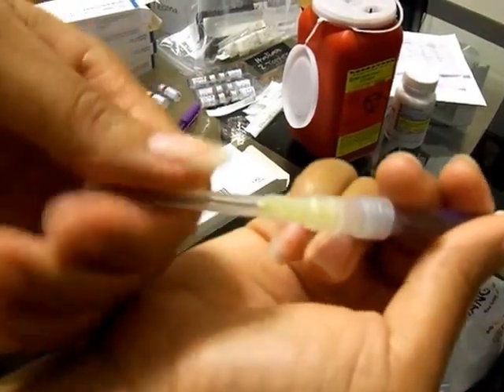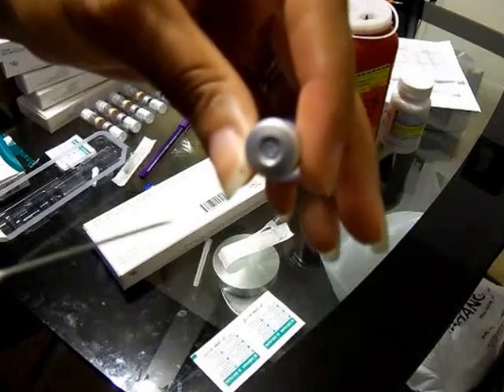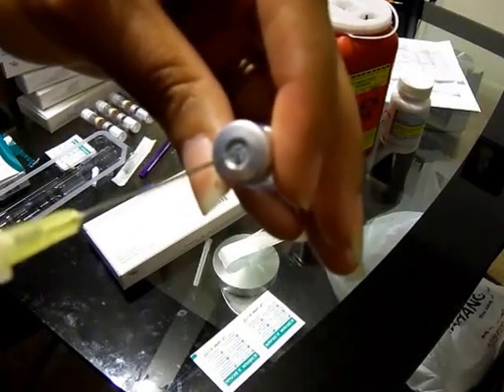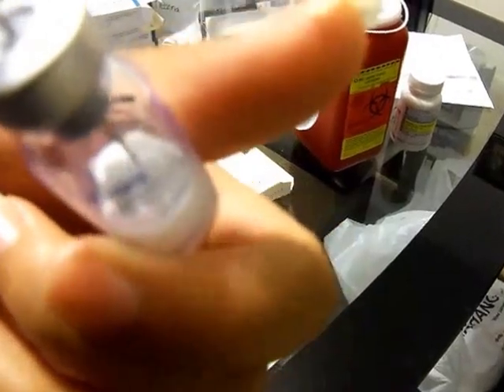Now what you want to do is take the cap off, and then inside — hopefully you guys can see this — you take it and stick it in the middle, and it starts to dissolve like that.